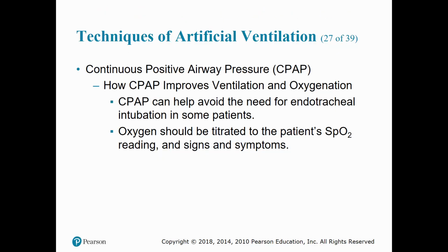CPAP is often used to avoid the need to place an endotracheal tube or other advanced airway to artificially ventilate your patient. A common goal of CPAP is to reduce a patient's work of breathing and buy time for more definitive treatments to work. As I already noted, CPAP is delivered via a tightly fitted mask and a device that generates a continuous flow of air through the airways under positive pressure that is higher than normal air pressure. The continuous delivery of air under positive pressure, which is measured in centimeters of H2O, is intended to inflate collapsed alveoli, improve oxygenation, improve pulmonary compliance, and reduce the patient's work of breathing.